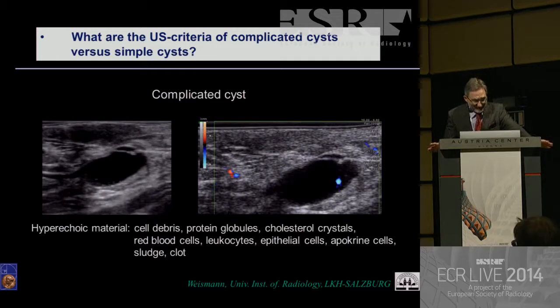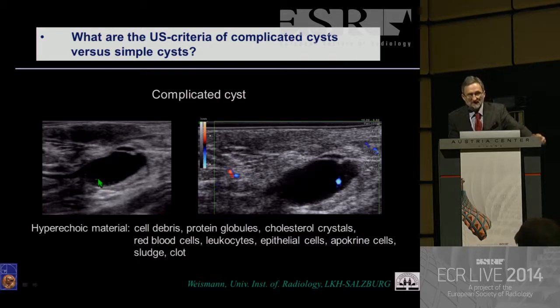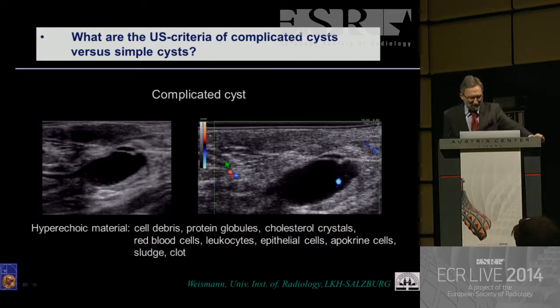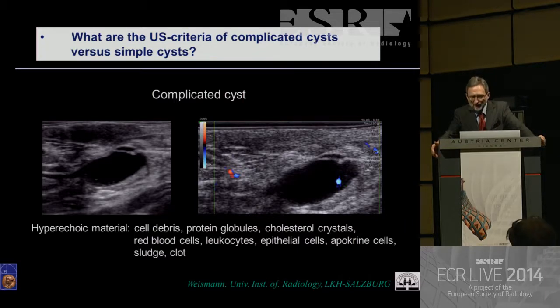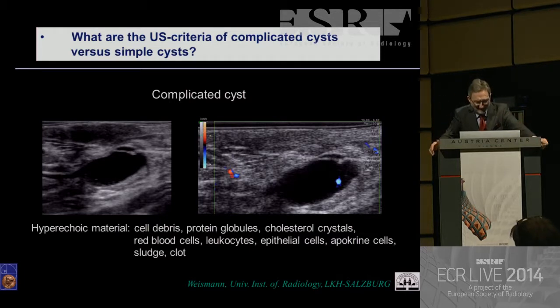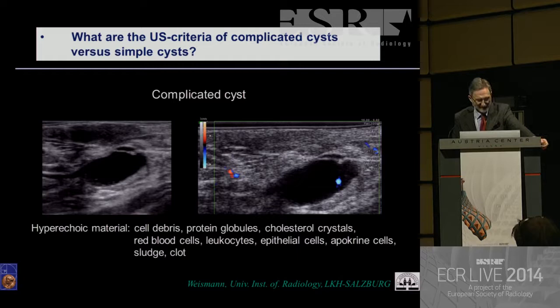Another example: you see some echogenicities inside the cyst — it can be debris, sometimes calcium. And if you activate the color Doppler, you can see some color popping up and moving through this anechoic fluid. This is typical for sedimentation of cell debris, globules, and crystals inside this fluid.